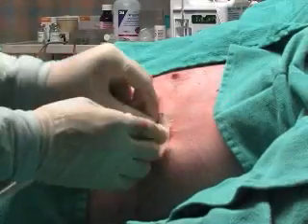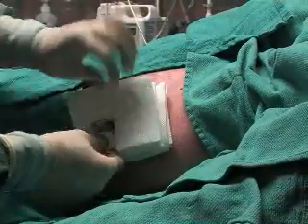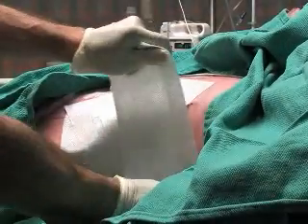Once the chest tube has been secured, a petroleum-based gauze dressing should be wrapped around it. Apply several pieces of sterile gauze around the tube. Secure the site with multiple pressure dressings.